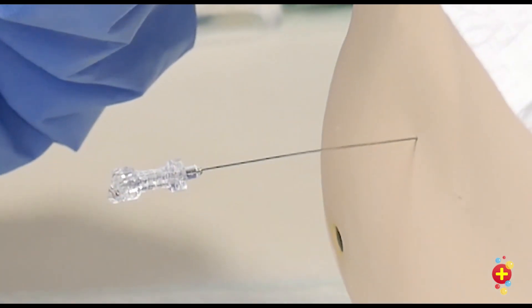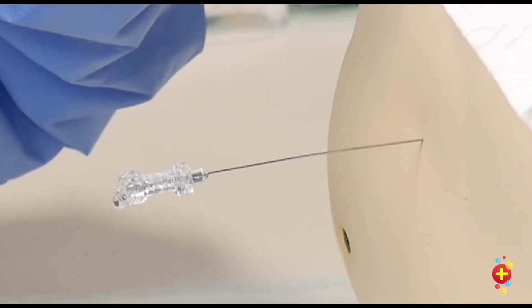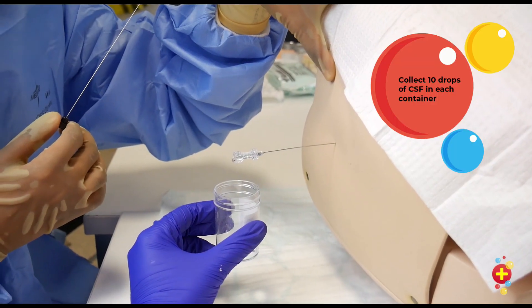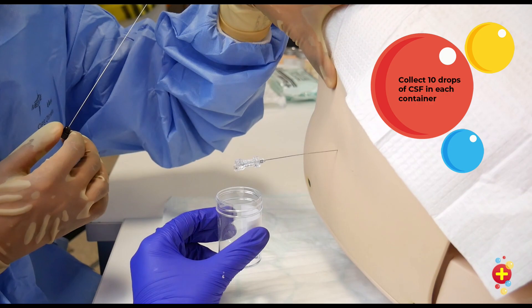And there we go, we've got some clear CSF, so we're going to catch it now. Ideally you want 10 drops of CSF in each container.